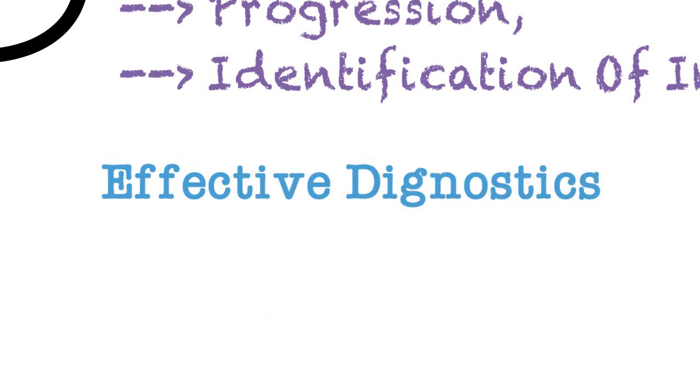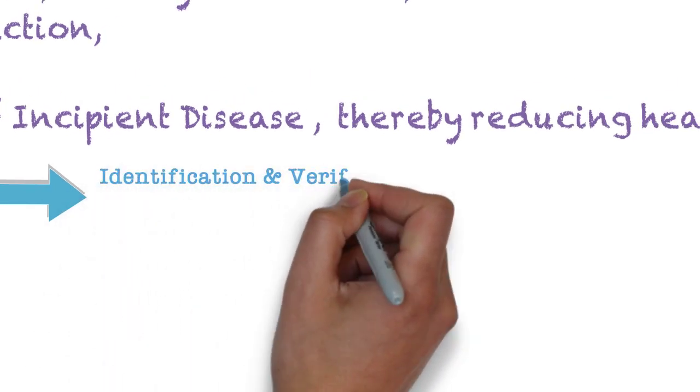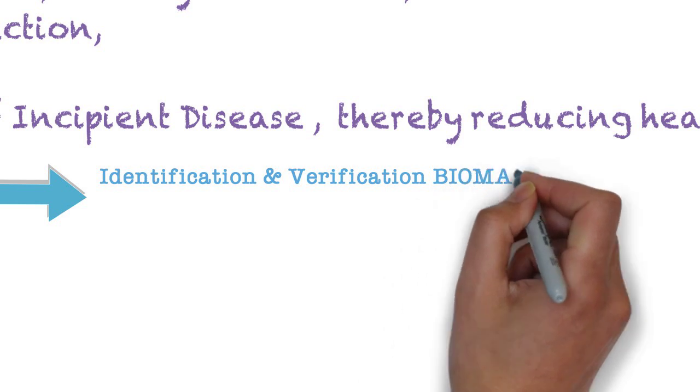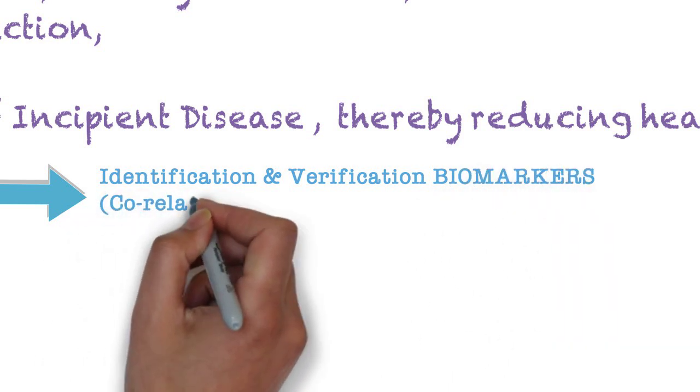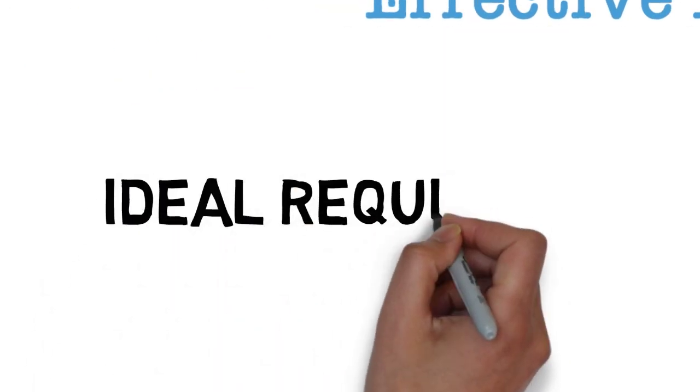Also, validation of an effective diagnostic requires both identification as well as verification of various biomarkers, and these biomarkers need to be correlated with disease progression. Let us know the ideal requisites of chairside diagnostic kits.